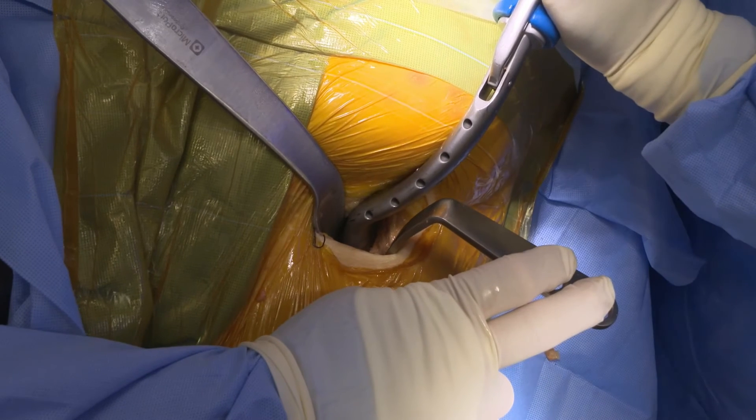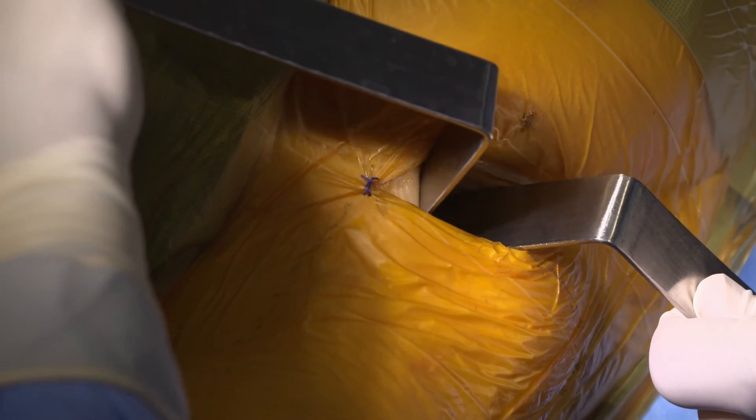All those things together should negate problems with damaging muscle or damaging the skin. Making the acetabulum easier actually makes the harder parts of the surgery easier. When you put your retractor medially and laterally and open it up, think about it — when you're bringing those retractors out instead of pulling against the skin, you're pulling within the line of your incision, so you're not putting tension on the skin whatsoever. That's one of the reasons the incisions look better.